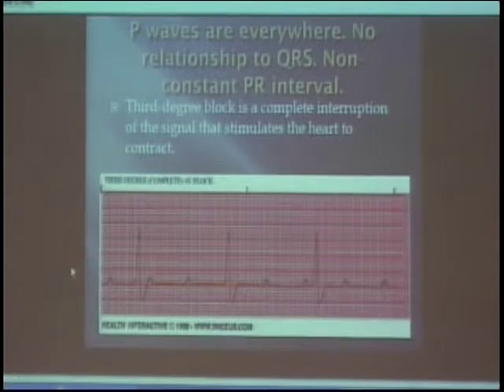Now you see, here's a P wave, QRS, P wave, P wave, QRS, P wave, P wave. This PR interval here is totally different than everything else. The P waves are marching through, and this rhythm here we're going to want to put the pacing pads on.